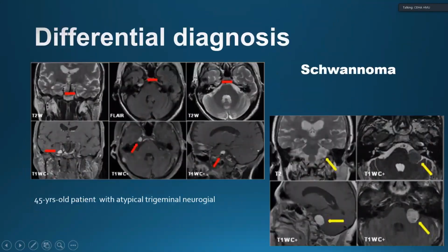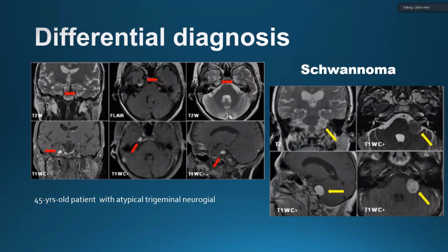And you know that on the 3D machine in our department, we can do the fusion between the TOF and the CISS, right?